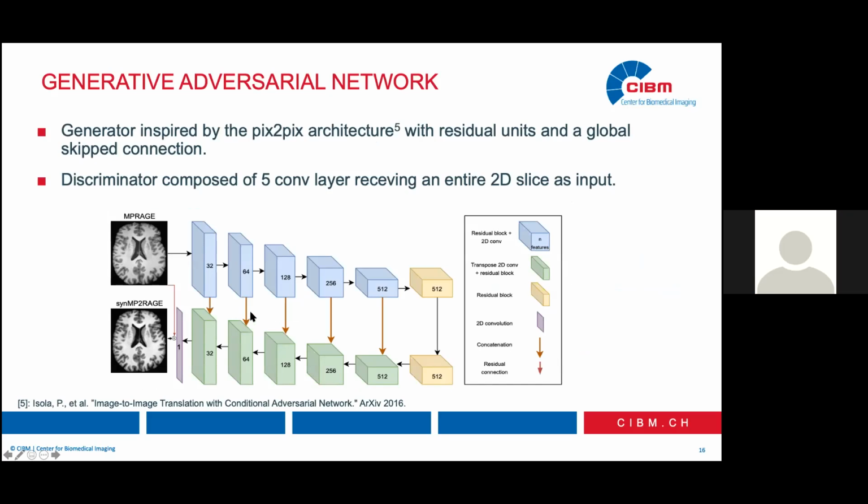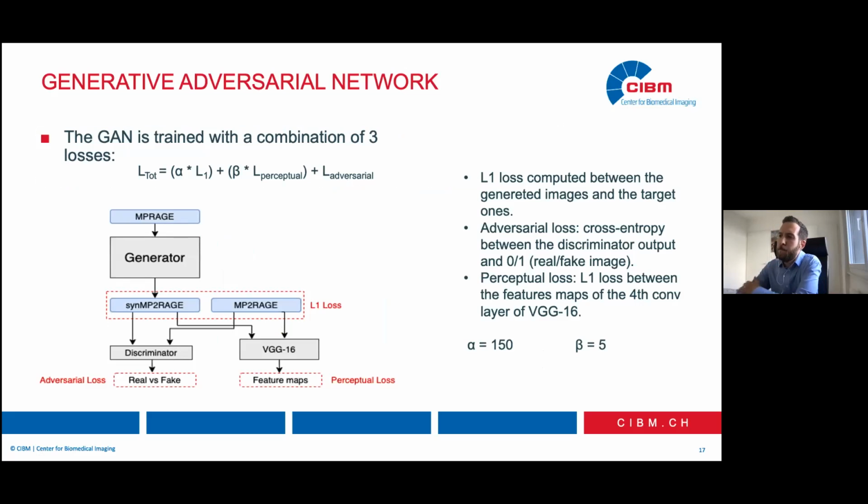Okay, thank you. Welcome. Yes, just go on. Yeah, go ahead. I was wondering about the VGG19 in your network architecture. Oh, VGG16, yeah, it's similar. It is used like a classifier to segment the lesions in the brain, so I'm not sure what it does here.